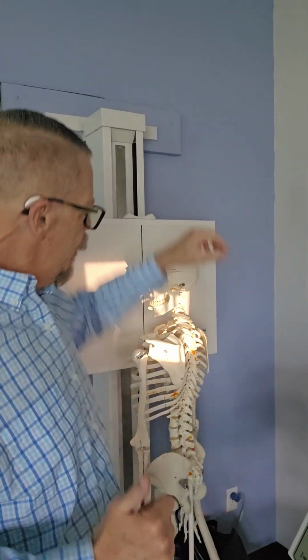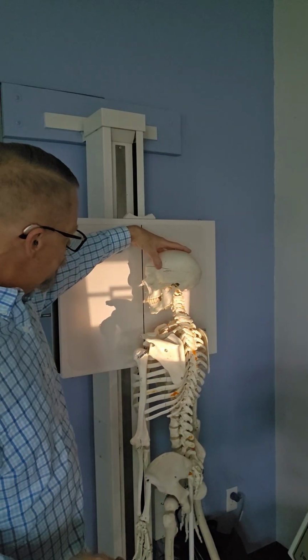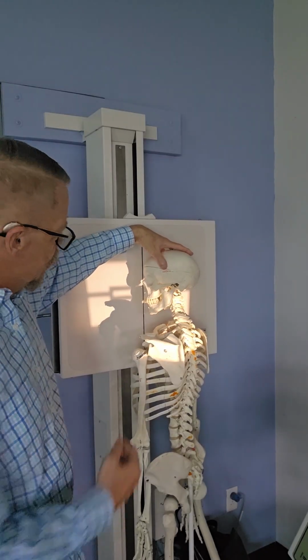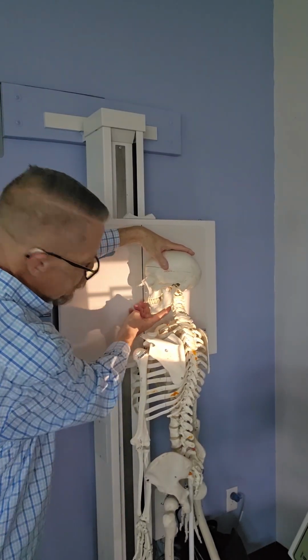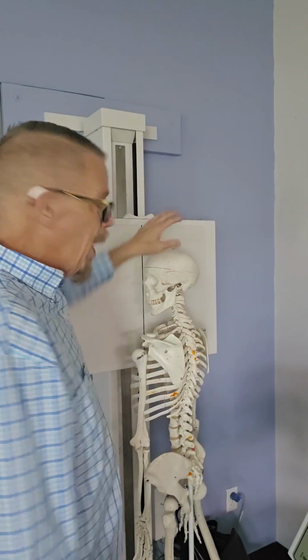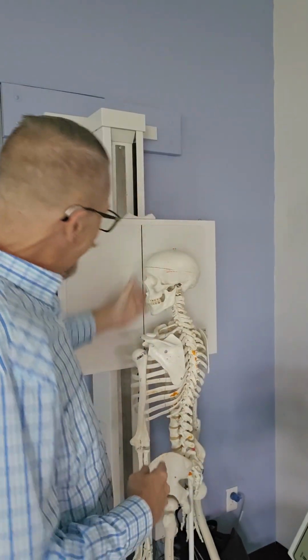You can also rotate the patient's head slightly. If you rotate the head 10 degrees towards the image receptor, you're going to get a good survey of the general mandible. If you leave the head perpendicular without any rotation, you're going to get a good image of the ramus of the mandible. I like to do the 10-degree rotation towards the image receptor. That gets the body of the mandible up against it better, gets it more parallel to the IR, and then we're able to get a good survey of that entire side of the mandible.